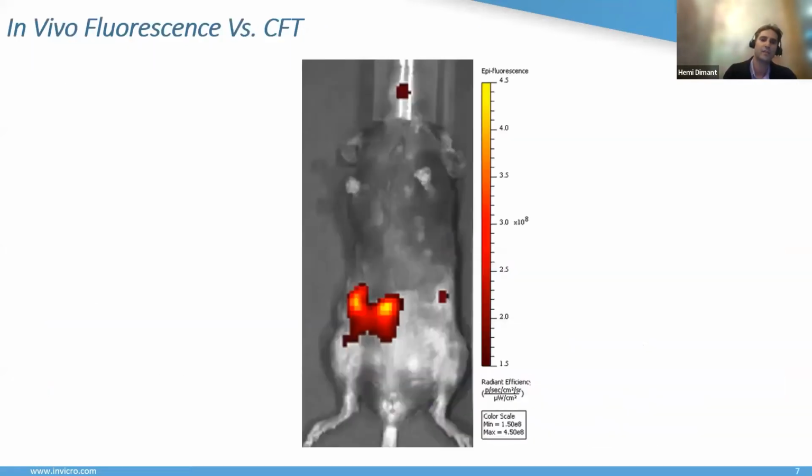And this is how in vivo fluorescence looks. This is an example of a tumor-bearing animal. I'm going to go into more detail about the actual case study and what we did here, but I just wanted to pique your interest and show you how an anesthetized live animal looks as we're imaging. Basically, we're looking at cells here, macrophages in a tumor.